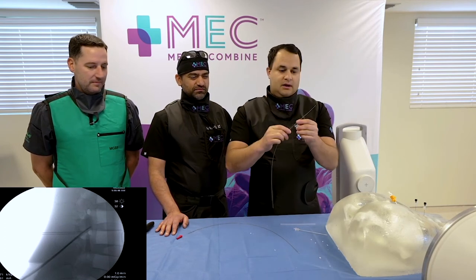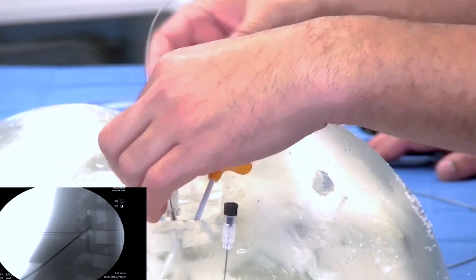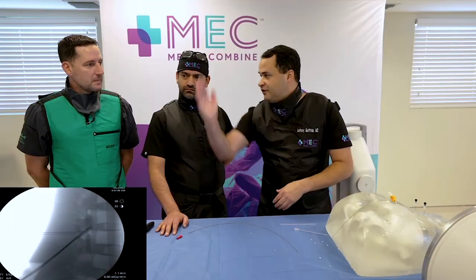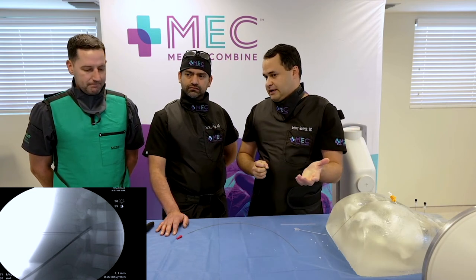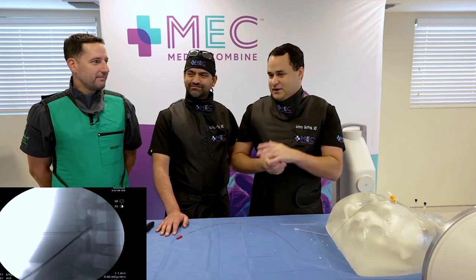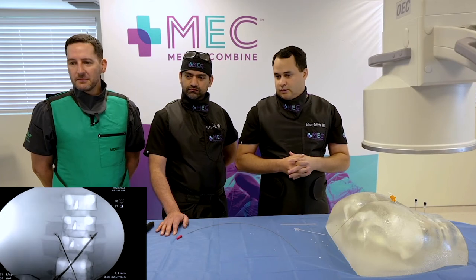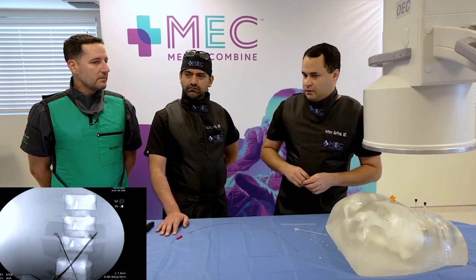The next step is to use a guide wire, which gives access to that area so we can put the sheath over it. If you're not through that muscle, the guide wire will actually deflect cranially at almost a 45-degree angle — that's a nice check to know you're through. People think we're in the foramen, but we're not. You use the foramen as a marking of where you want to be. When we come back AP, you can see we're way lateral — that's where we want that guide wire to be.